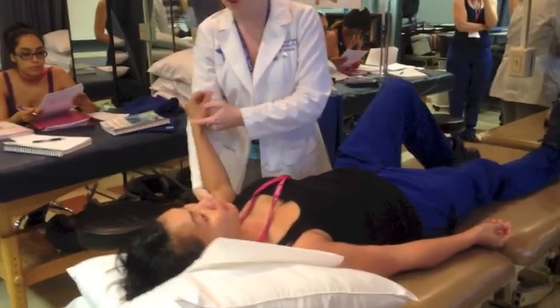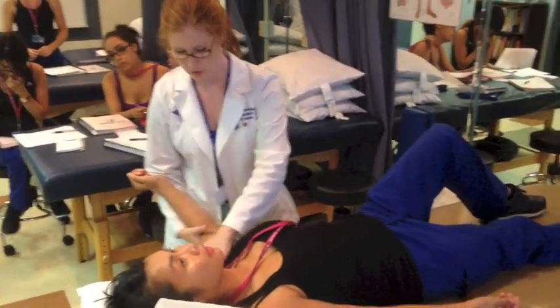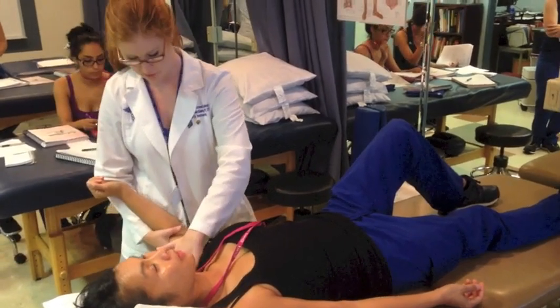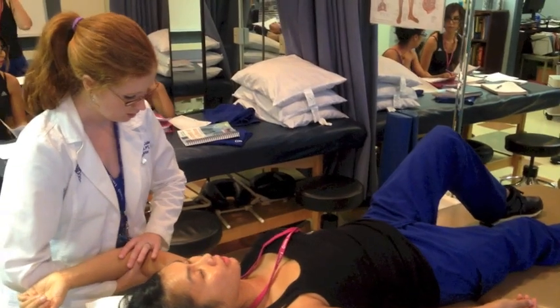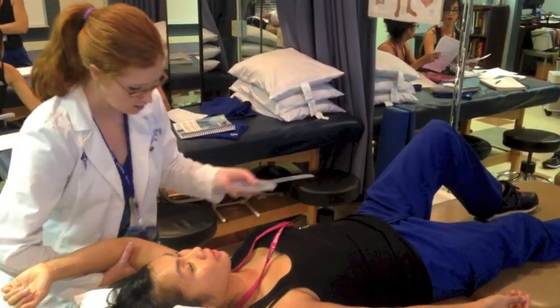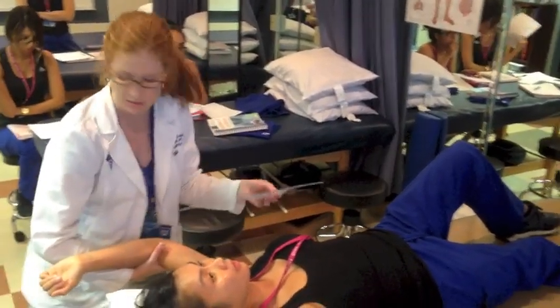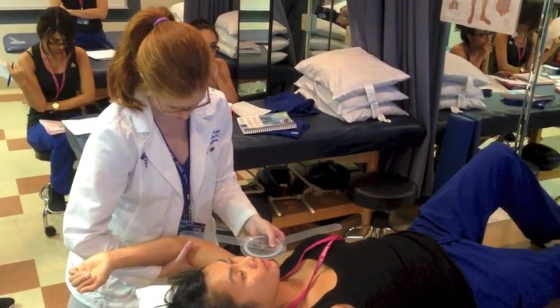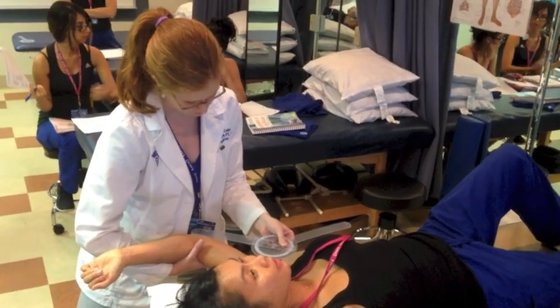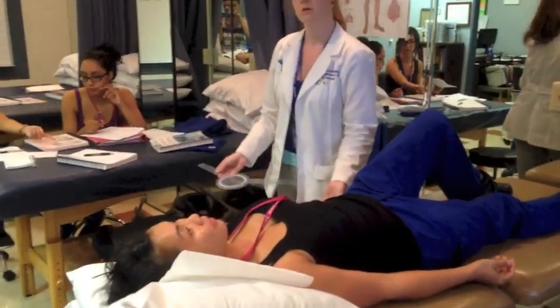Taking her arm again, I'm watching to make sure I'm in the correct plane and not letting her entire shoulder elevate. If I need to keep it down, I can. I'm bringing it up and I want to stop about right there. We're in this frontal plane — don't switch to the flexion plane, because that's not what we're measuring. I barely have to move it, and we got 132 degrees.